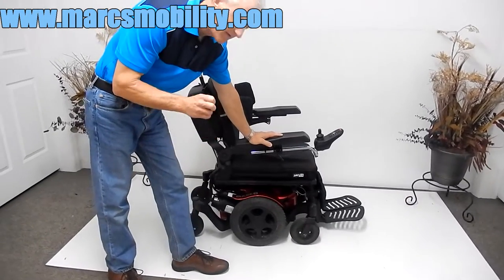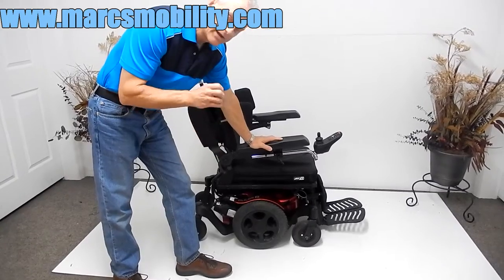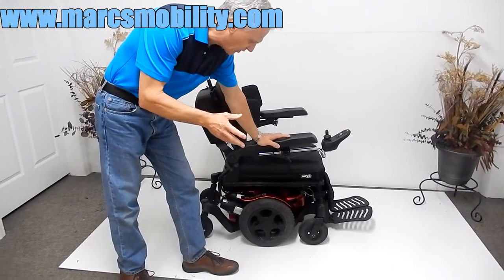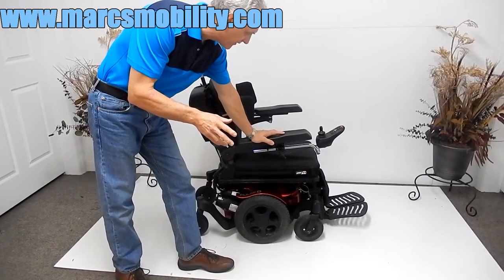This is a Quickie Pulse 6 power chair. This power chair has electric tilt, electric recline, and electric legs. It has solid tires all the way around and great suspension — I'll go over the suspension in a few seconds.